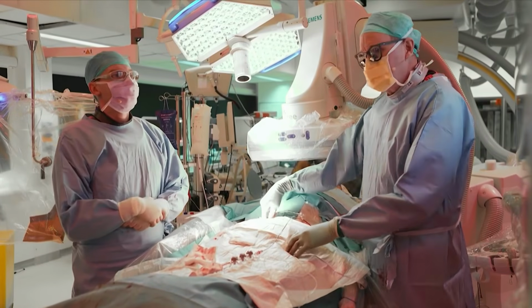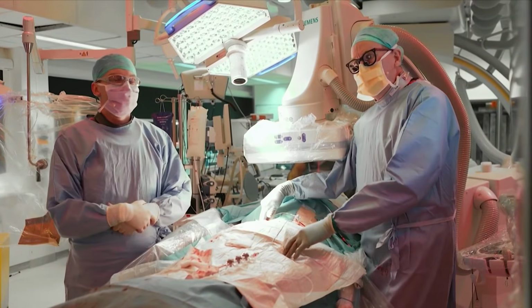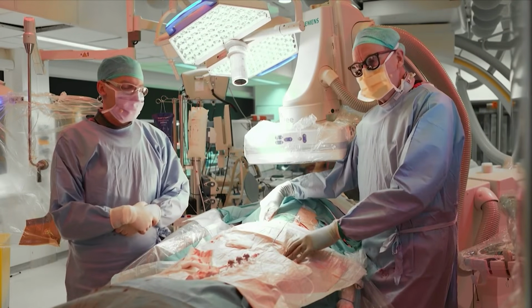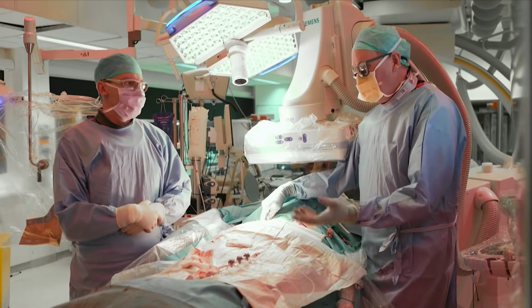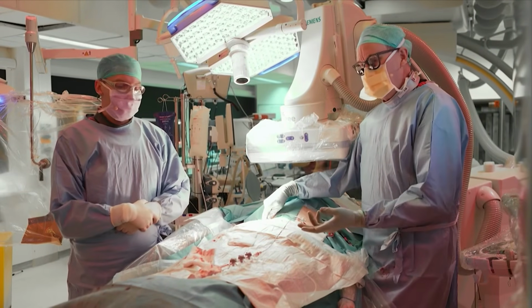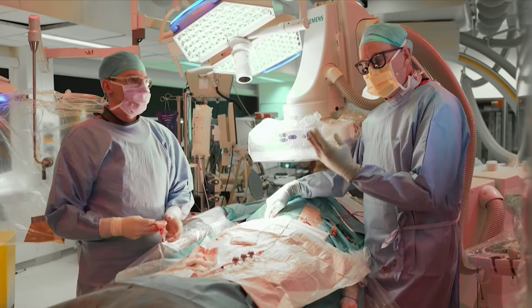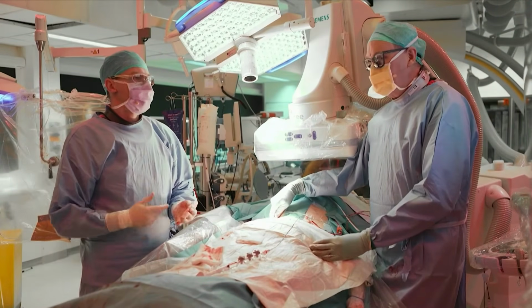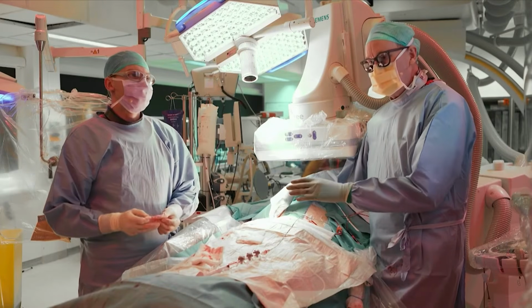I think the only cases are when you have a patient who's hemodynamically unstable where you want to rush the procedure a little bit. That's the only time we don't use commissural alignment. But even in this case, if you go with a flush port at 6 o'clock, you have at least a very good chance to have a well-aligned valve, even if you don't assess every single step.